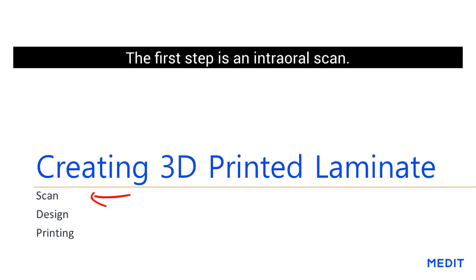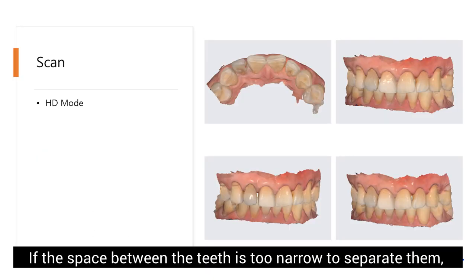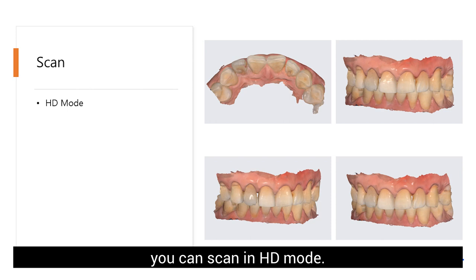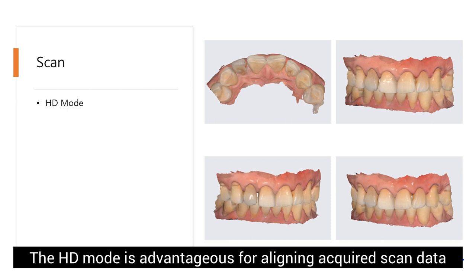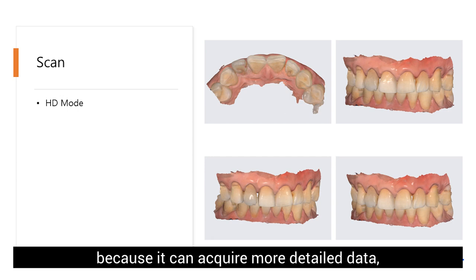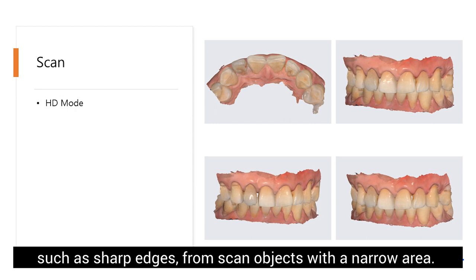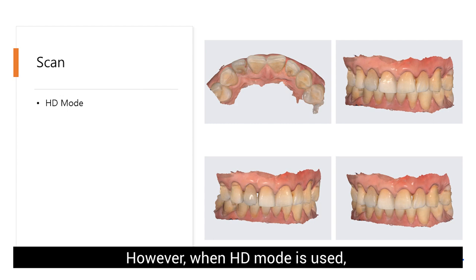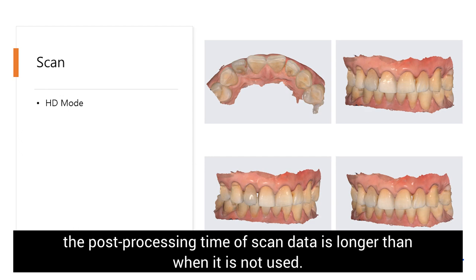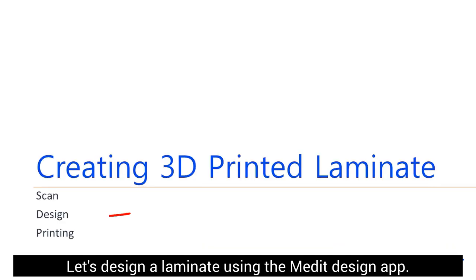The first step is intraoral scanning. If the space between the teeth is too narrow to separate them, you can scan in HD mode. HD mode is advantageous for acquiring more detailed data, such as sharp edges from scan objects with narrow areas. However, when HD mode is used, the photo processing time of scan data is longer than when it is not used. Let's design a laminate using the Medit Design app.